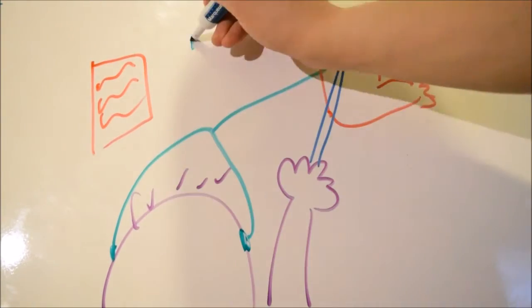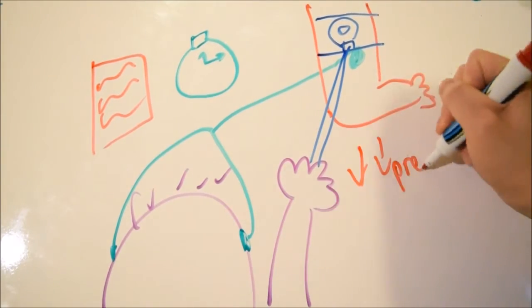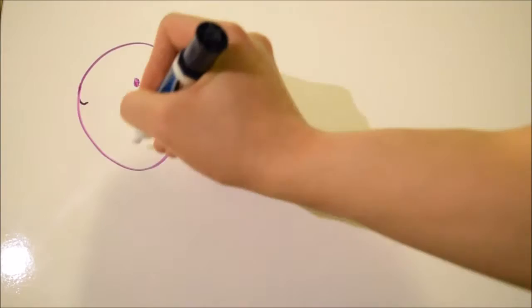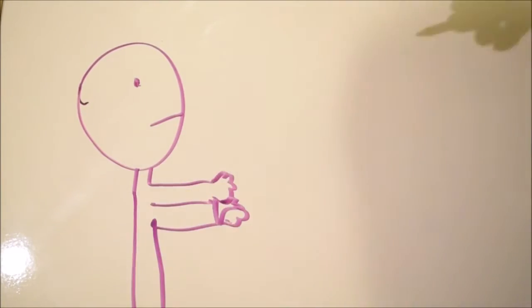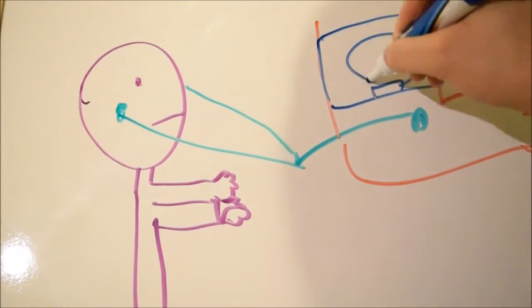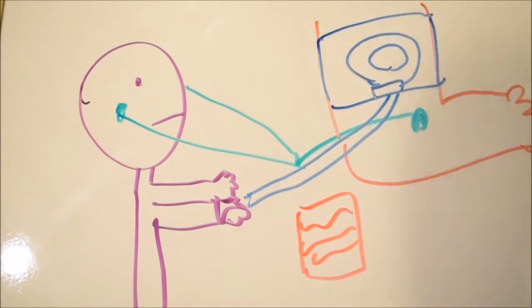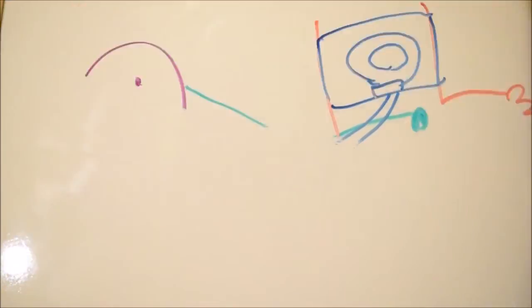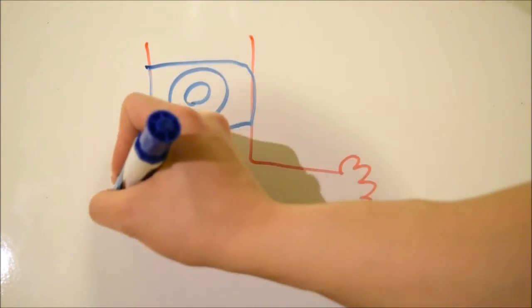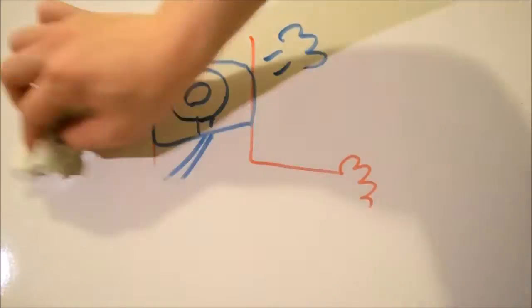Then immediately tell the recorder and the timer to get the current pressure and begin timing the duration of the Korotkoff sound. After the first Korotkoff sound is heard, the director must continue listening until it finally stops. Then tell the recorder the current pressure, so then the timer will stop the recording and we have the duration. The blood pressure cuff should now be completely deflated and the subject should be given a couple of minutes to rest before the next experiment.